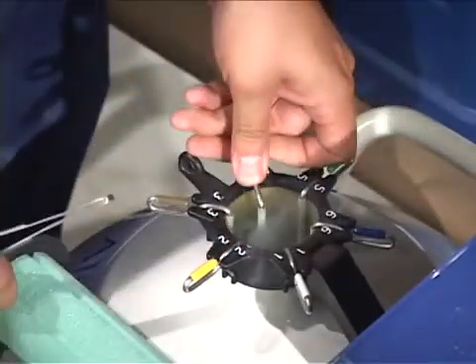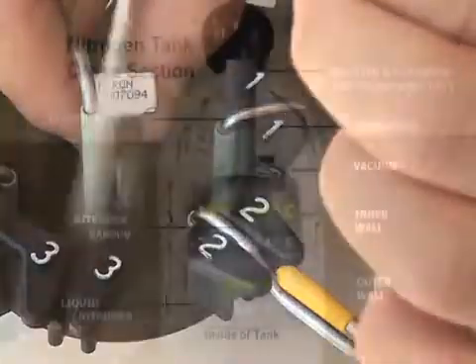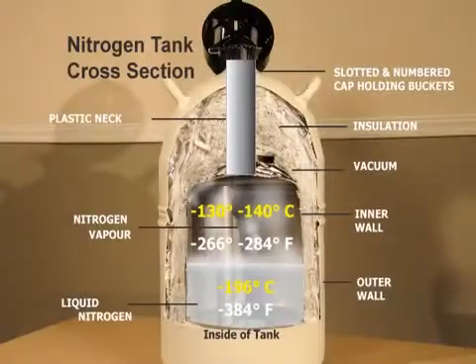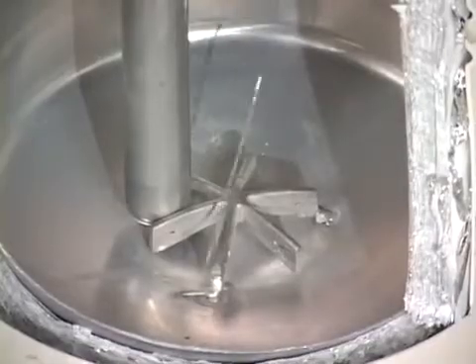Once the straw has been removed, make sure to put back the lid of the tank and close it correctly. Many breeders lose canes of semen to the bottom of the tank because they do not handle the canister and the cane of semen correctly.